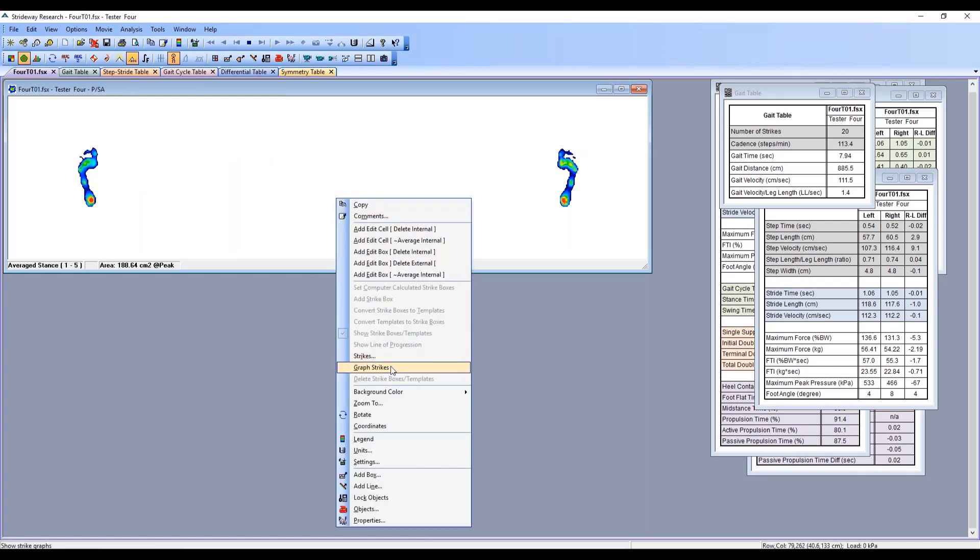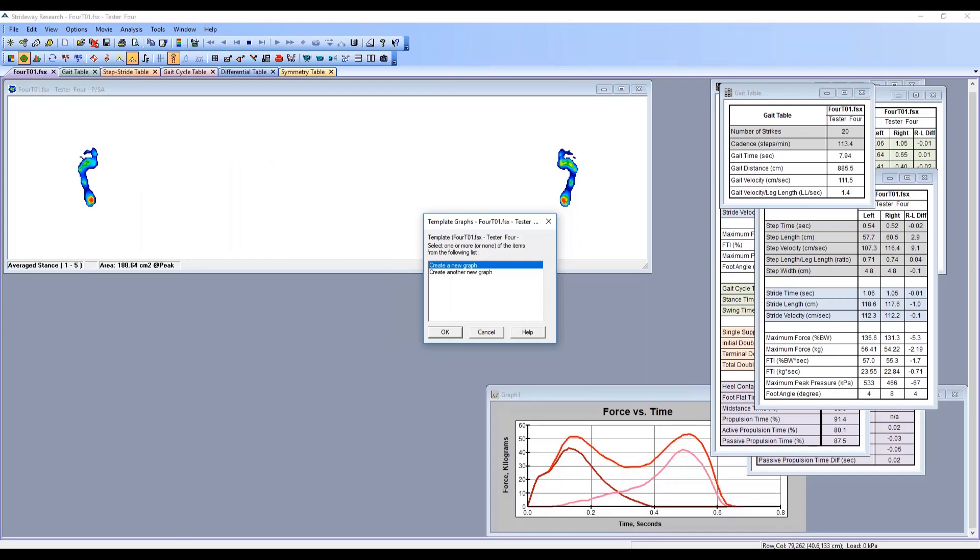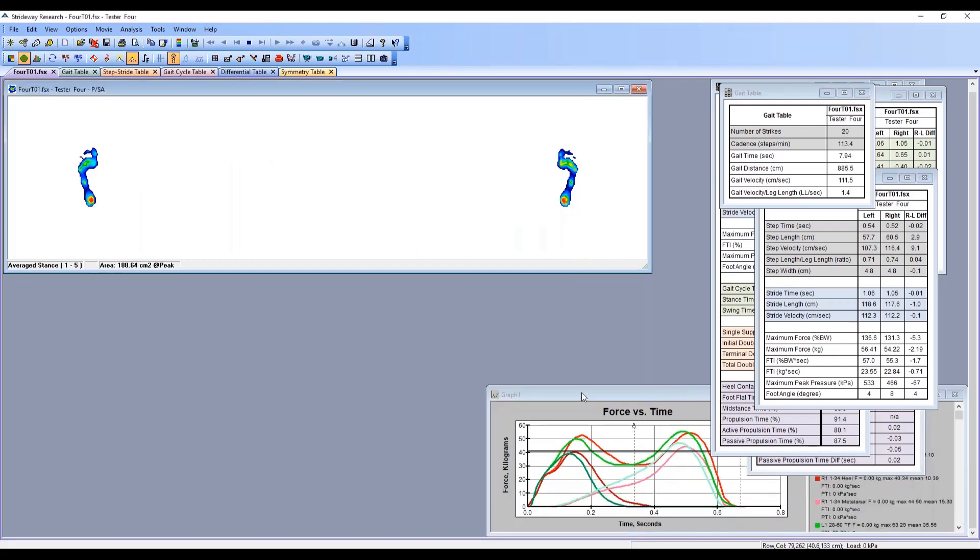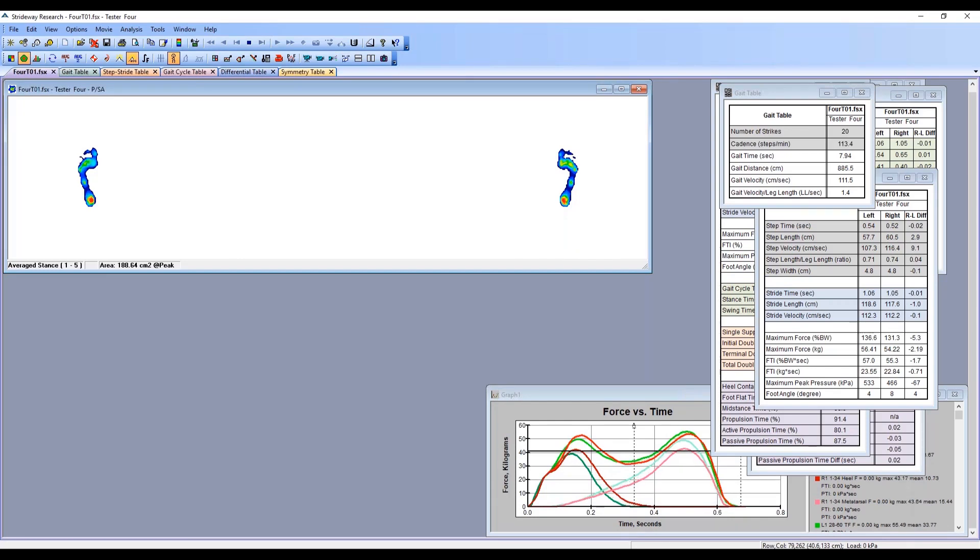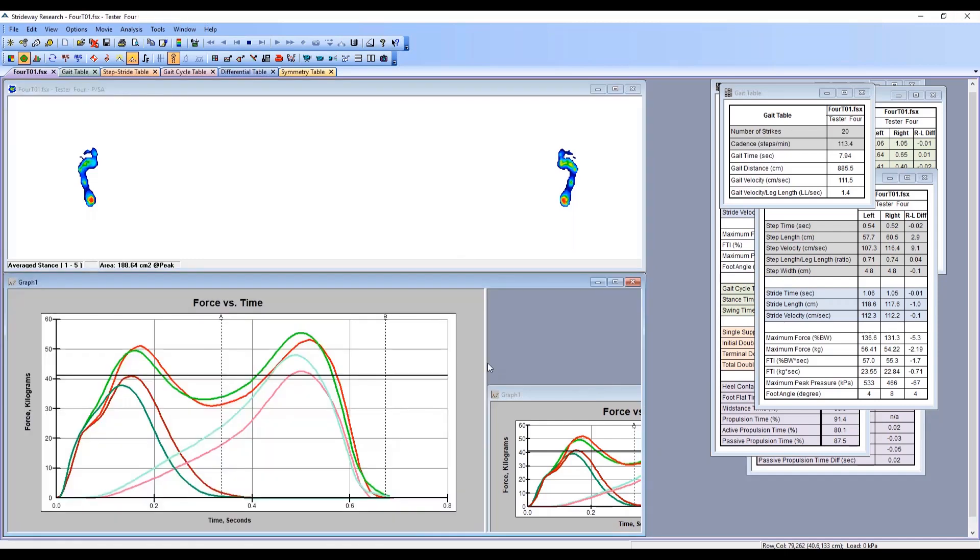Let's go and graph our strikes here. As it's loading, we'll just get the average force versus time curves, except now we'll have it broken down into the template that was created on top of the feet. So we'll have a heel component and we'll have a forefoot component curve that we'll be able to look at as well.